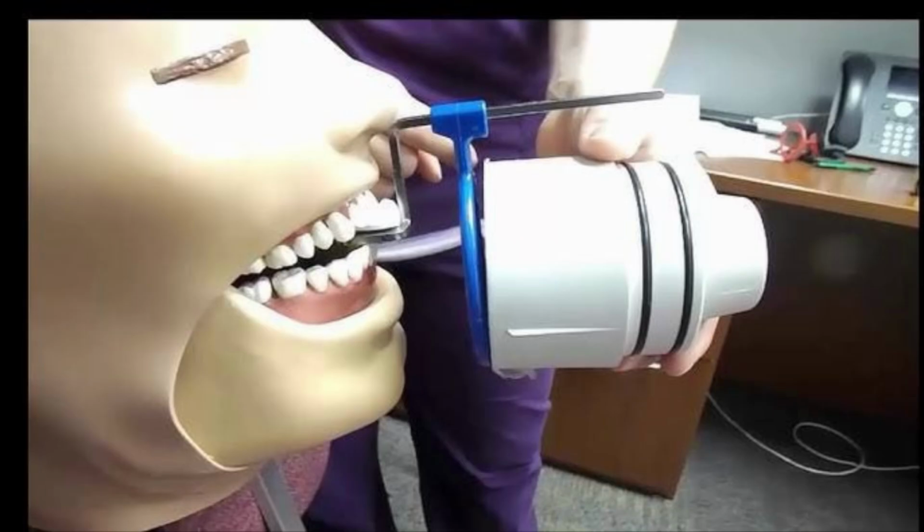Coming to the radiological examination, these two radiographs are commonly used for the assessment of the maxillary midline diastema. One is the periapical radiograph, and as I said in the start, the periapical radiograph has to be very standardized. For example, the angulation of the tube and the film has to be exactly at the right angle, and you must use the holder while taking the periapical radiograph if you are assessing a case of the diastema, because the U-shaped or V-shaped notch can be missed if you do not have the proper angulation of the radiation.